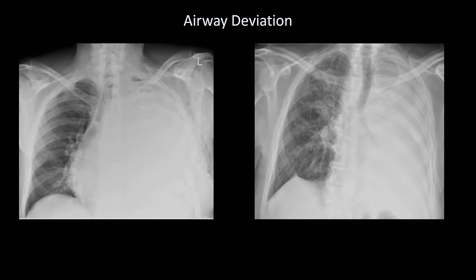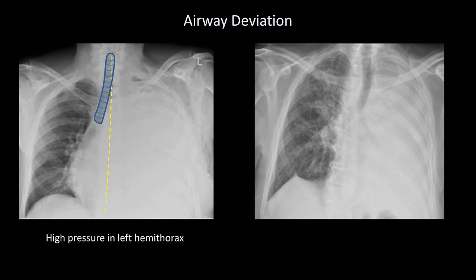Usually the underlying condition leading to airway deviation is quite obvious, and knowledge of which conditions push the trachea away versus pull the trachea towards the abnormality is not critical. However, here is an example of when it is critical. Consider two x-rays in which the left hemithorax has been totally whited out. If we draw a midline down the vertebral bodies, we can see that the trachea is deviated away from the whited out side. Therefore, the abnormality must be causing excessive intrathoracic pressure on that side, and is thus a massive left pleural effusion.